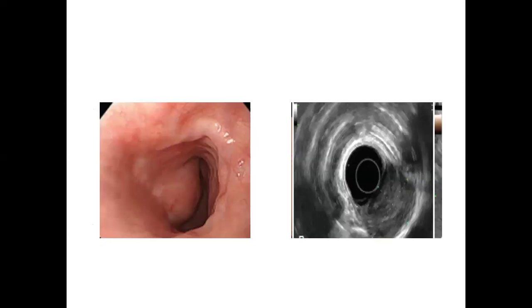So basically, endoscopic ultrasound combines two very important topics. It combines the knowledge of gastrointestinal endoscopy procedures. It also combines the knowledge of sonography. I presume most of our members in this group have knowledge in sonography, but now we are going to combine endoscopy and sonography on how we are going to approach certain lesions that can occur in the body. Endoscopy can be in any part of the body, but the one I'm going to discuss today touches on gastrointestinal endoscopy, meaning both upper and lower gastrointestinal endoscopy, and combine the two topics.